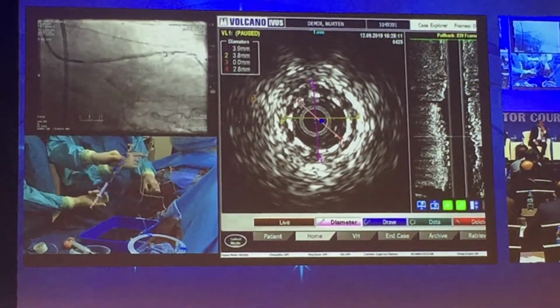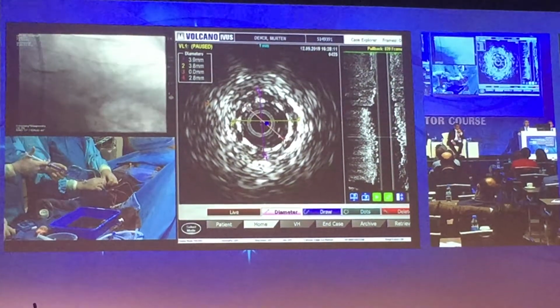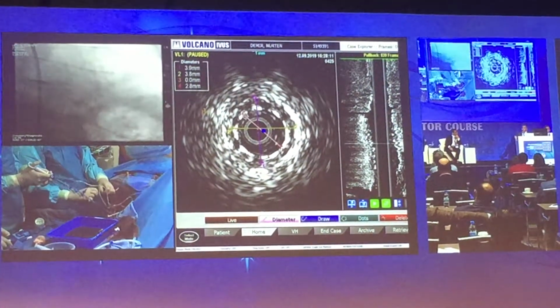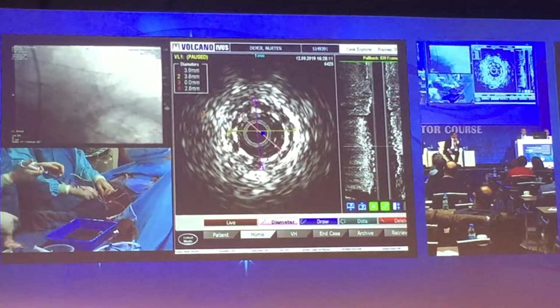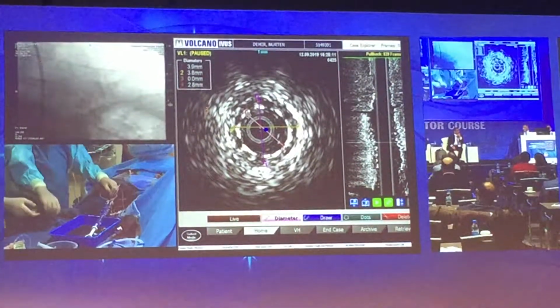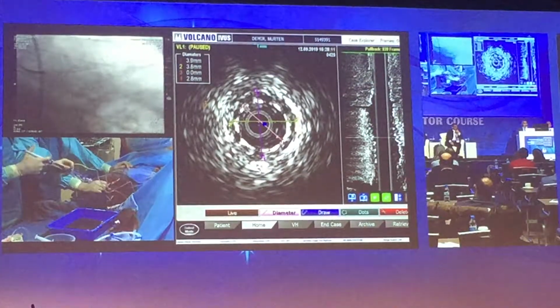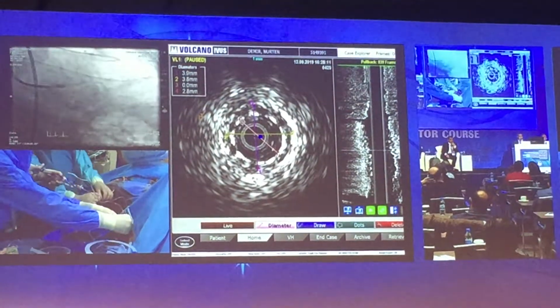Okay. Now let's take cranial. Nitrate. The catheter engages directly to the coronary artery and causes proximal stent deformation, especially in circumflex arteries. And you have to be cautious about this. When you are dealing with a proximal lesion or a left main lesion, your risk of proximal deformation is very high, and this will increase the risk of stenosis and thrombosis. So you should deflate well and push gently, and maybe sometimes take the catheter off the coronary artery and set the device like this. So you have to be cautious when you are dealing with a proximal lesion. Cranial view.